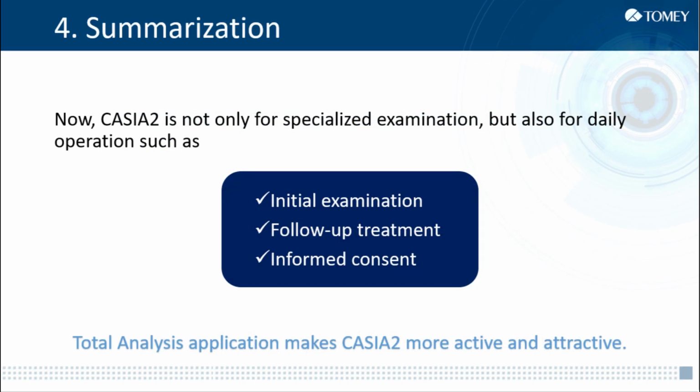Here is the summarization. Now, with total analysis, CASIA 2 is more easily used for daily operations such as initial examination, follow-up treatment, and informed consent, and helps doctors to maximize the use of CASIA 2. That brings me to the end of the documentation.